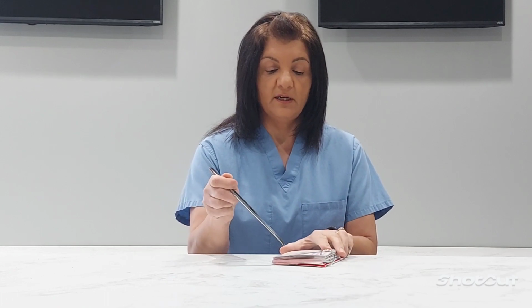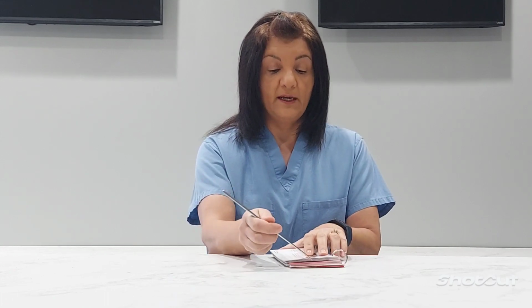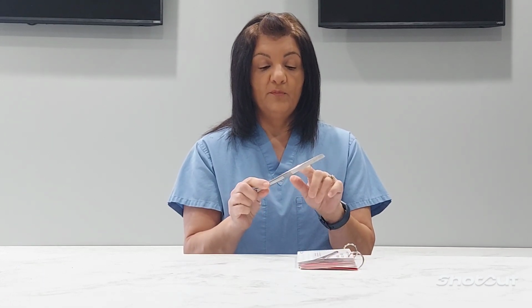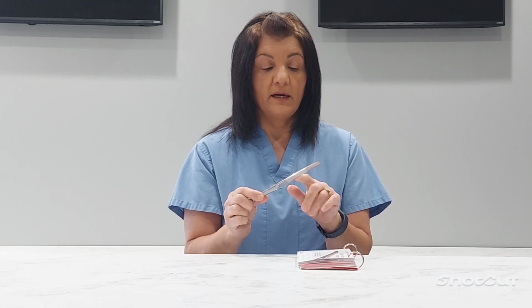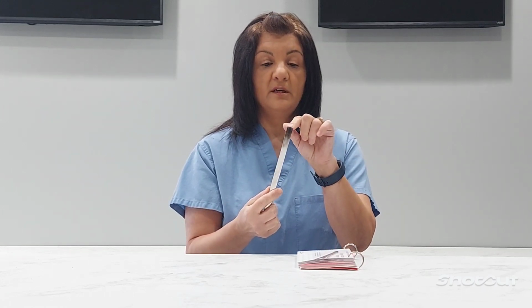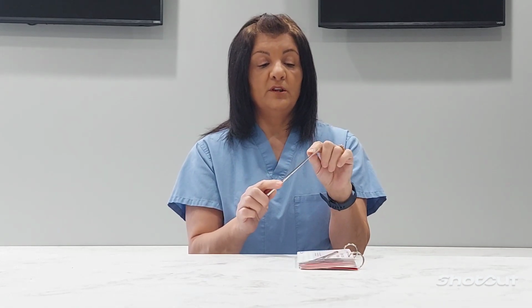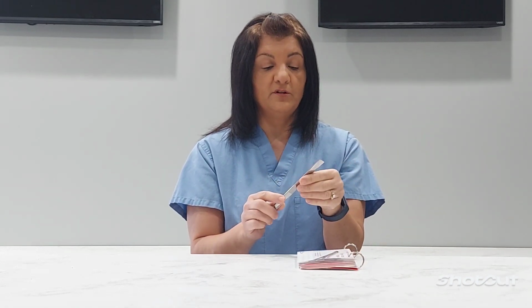So when we're going to test our osteotomes, for example, it's supposed to stick in here at a 90-degree angle. And this one I know for a fact is not safe because it's kind of messed up in a whole lot of ways. So we're checking for pits, stains, rust, cracks. We're checking for the sharpness across the top. This particular one has a giant stain on it. And I can also see where the staff has tried to scrub the giant stain, so they have further damaged this instrument. So there are several reasons why this instrument has been pulled from use. We cannot use them when they're stained because that is the start of the degradation of your instrument.